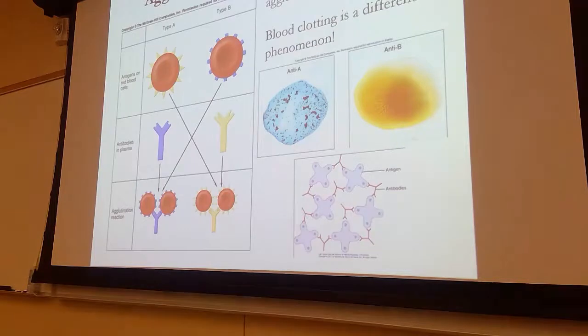Anti-A antibody comes prepackaged in a blue solution. That's why you saw the blue on the screen. When this antibody was added to a drop of blood, it colored the blood blue. That's why you see the blue splotch on the screen. Anti-B antibody, you're seeing the yellow, comes in a yellow solution. See? And anti-Rh antibody comes packaged as a clear solution.